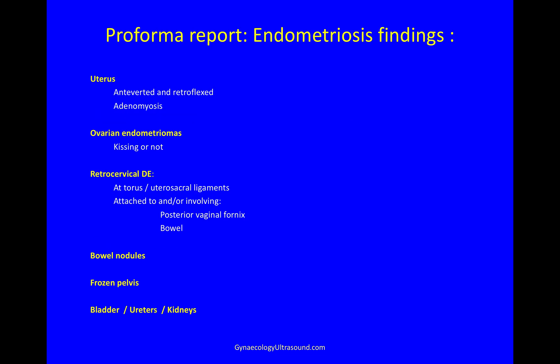As I go through the scan I build up a report in my head, looking for features of endometriosis: whether the uterus is anteverted and retroflexed, if there's adenomyosis, if there are ovarian endometriomas and whether the ovaries are kissing or not, if there's retrocervical deep endometriosis at the torus and uterosacral ligaments, which can be attached to and/or involving the posterior vaginal fornix and bowel.